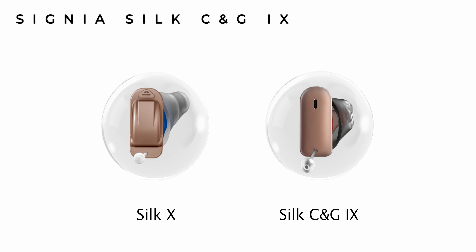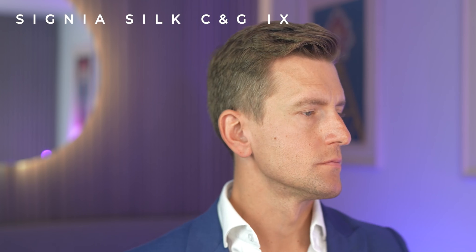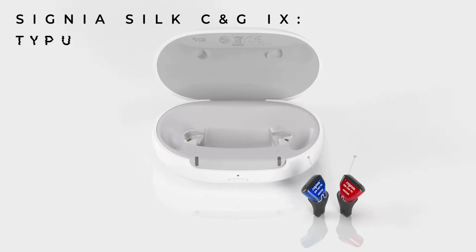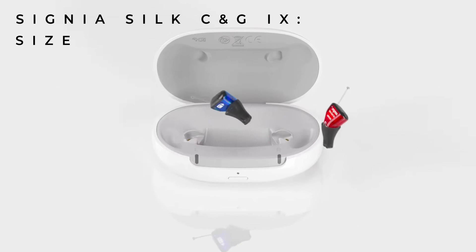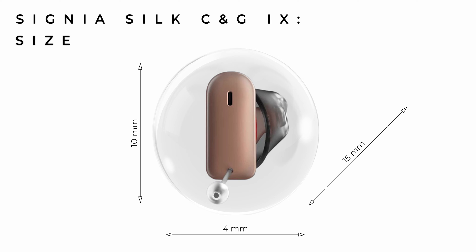And for the battery to perform as well as it does. The only difference you'll spot between the two is that there's no longer an openable battery door on the rechargeable version. For those unfamiliar with the Signia Silks, they're shaped in a torpedo way and ergonomically designed to mirror the shape of an average ear canal, measuring 15mm long, 10mm tall, and only 4mm in diameter.